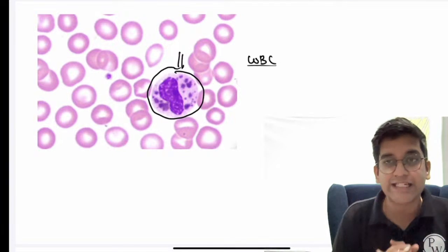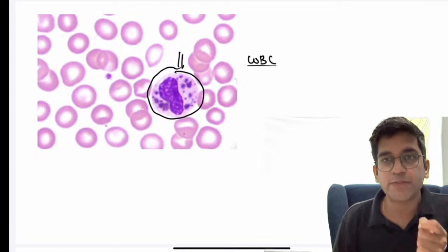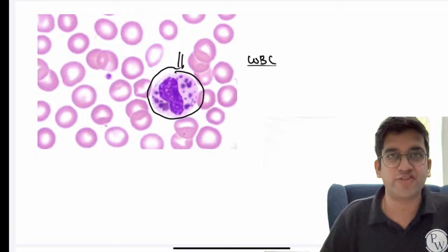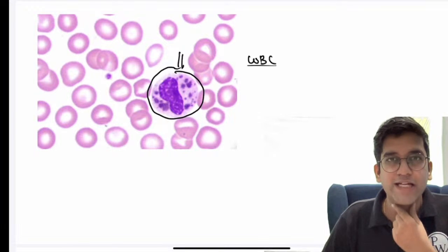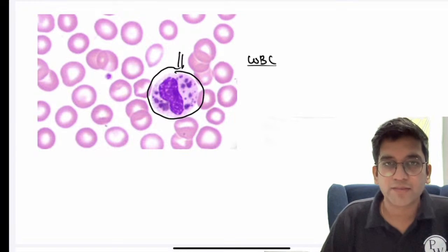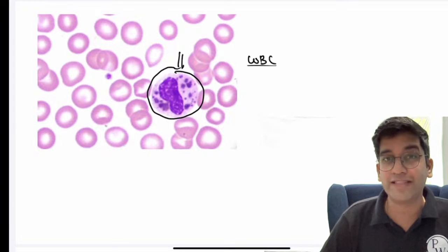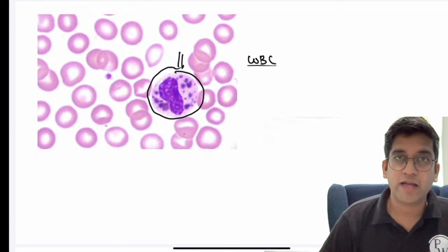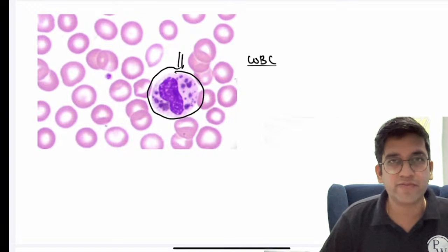I'm having a classical coarse granulation. It's not a multiple myeloma. I'll give you a clue for this patient. This patient presented with immunodeficiency. That's a clue here. I'll add one more clue. This patient also has a very hypopigmented or pale patch on the face. Kind of a toxic granule, but that toxic granule will not be this prominent. Immunodeficiency, hypopigmentation or albinism in the face, peripheral neuropathy.